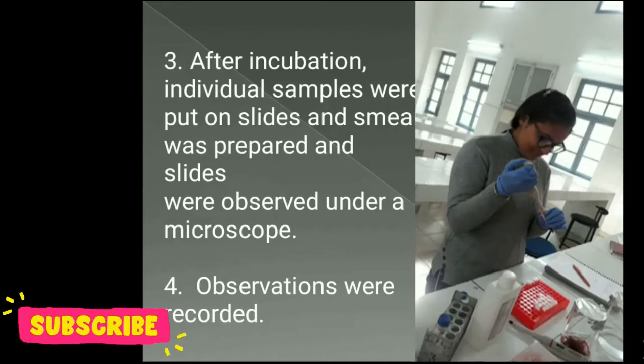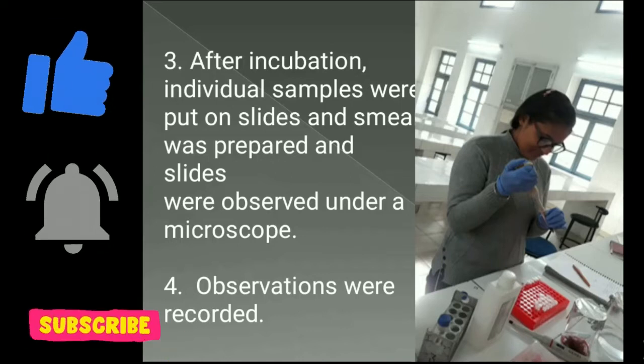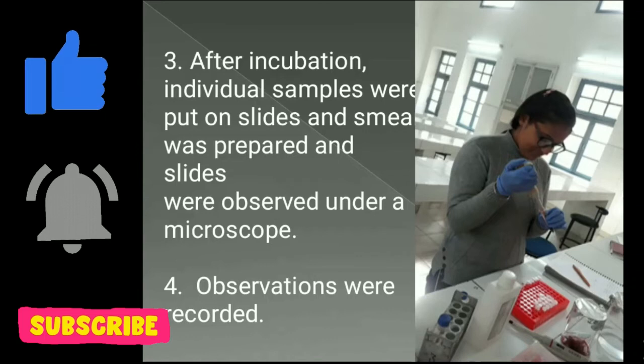After incubation, these samples are then used for making smears, and these smears should be thin. Then these smears or slides are observed under the microscope, and the observations are recorded.